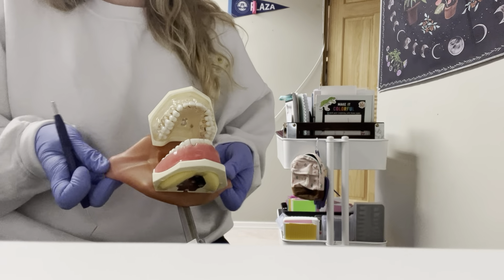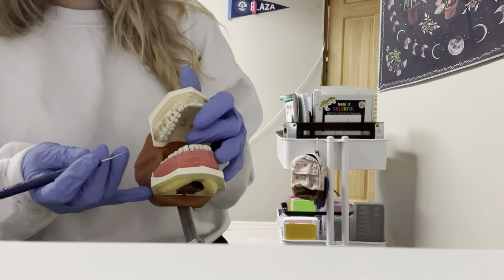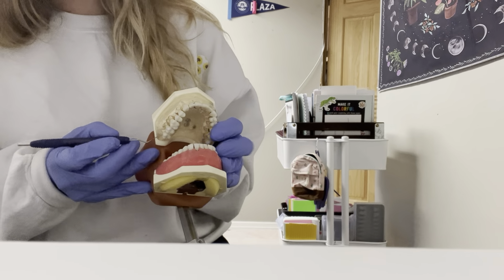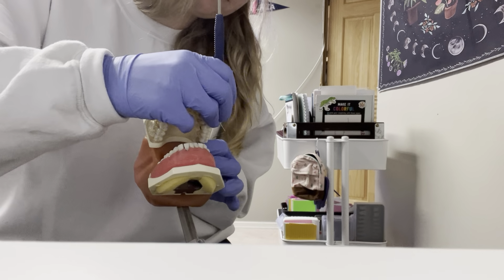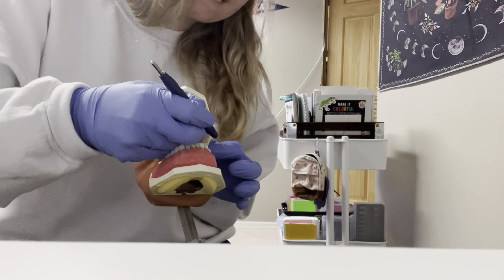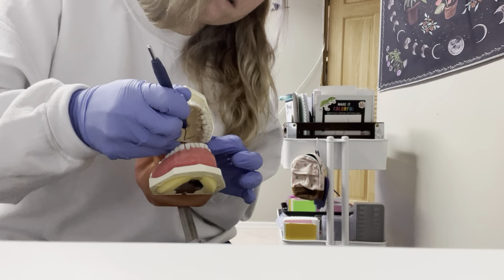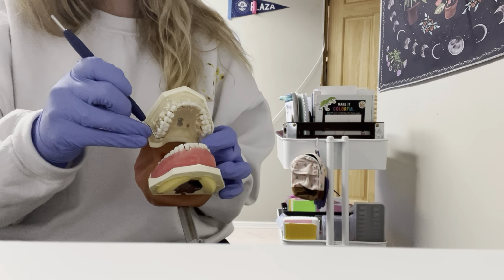There's a certain working order that you always follow when you're probing. You're going to go from the upper right, which starts at tooth number 1, to the upper left, tooth number 16. You're going to start with the buccal, and then you're going to drop down to the palatal side of 16 and go back to tooth number 1.